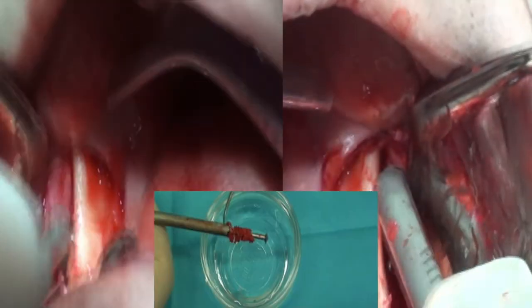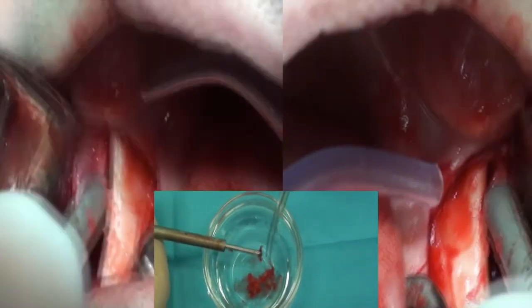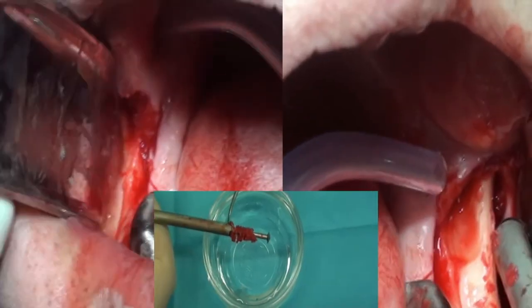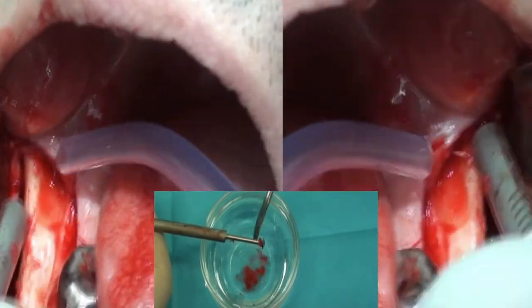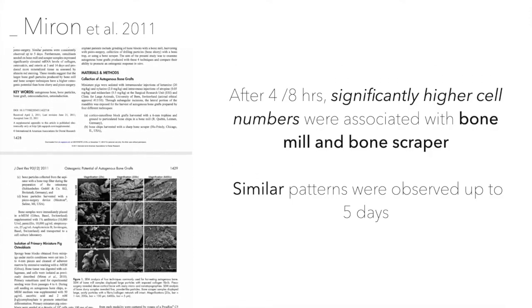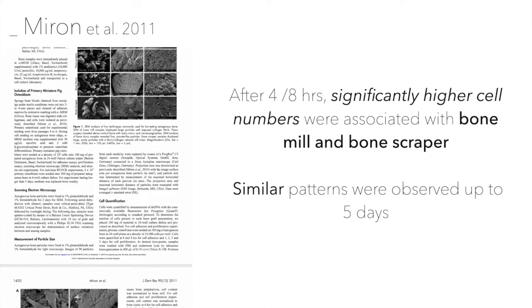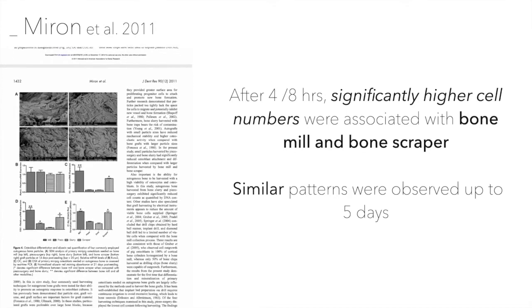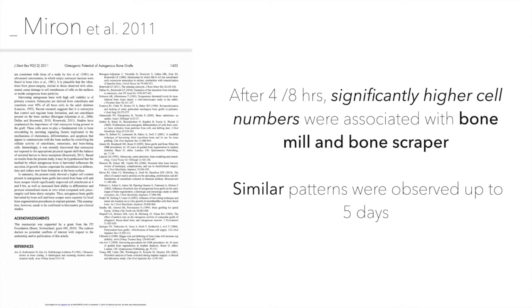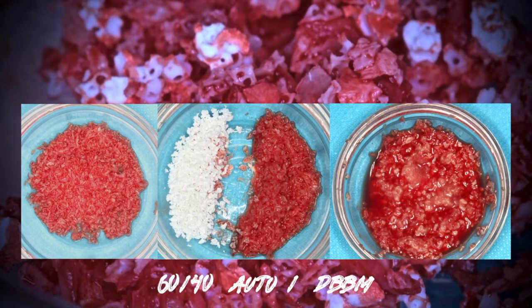We then collect autologous bone from the mandibular ramus using a bone scraper, using a single surgical site as both donor and recipient site. As described by Richard Myron, bone scrapers and bone mills result in significantly higher cell numbers after 4 and 8 hours compared to other techniques. The collected autologous bone is mixed at 60% autologous bone and 40% Bio-Oss in large particle size (2g Bio-Oss), because small particles would escape through the membrane holes.